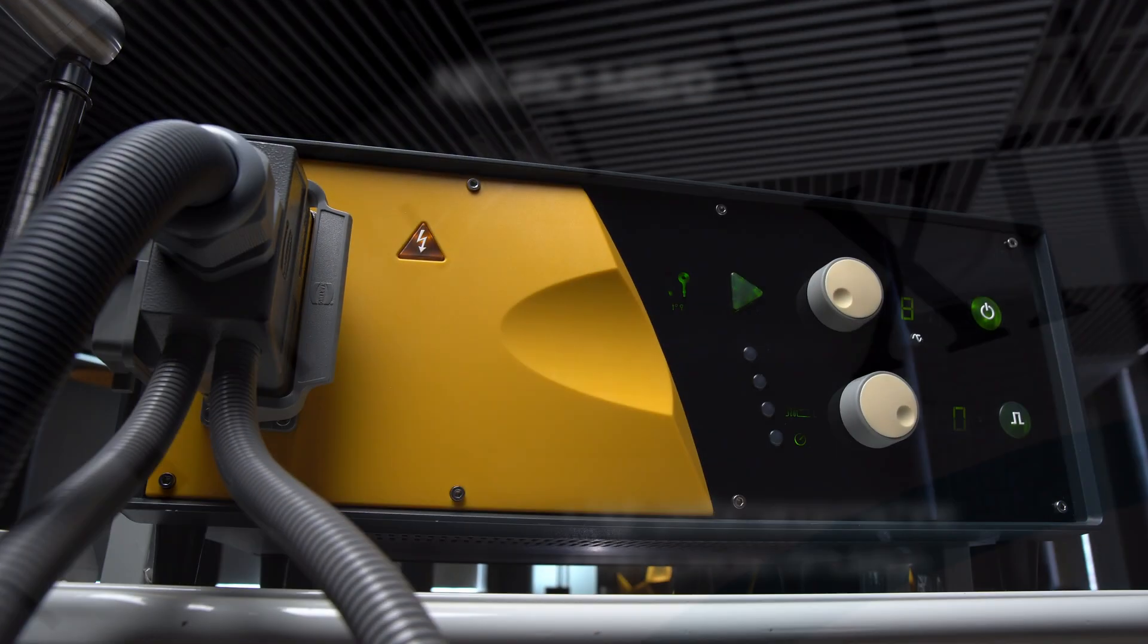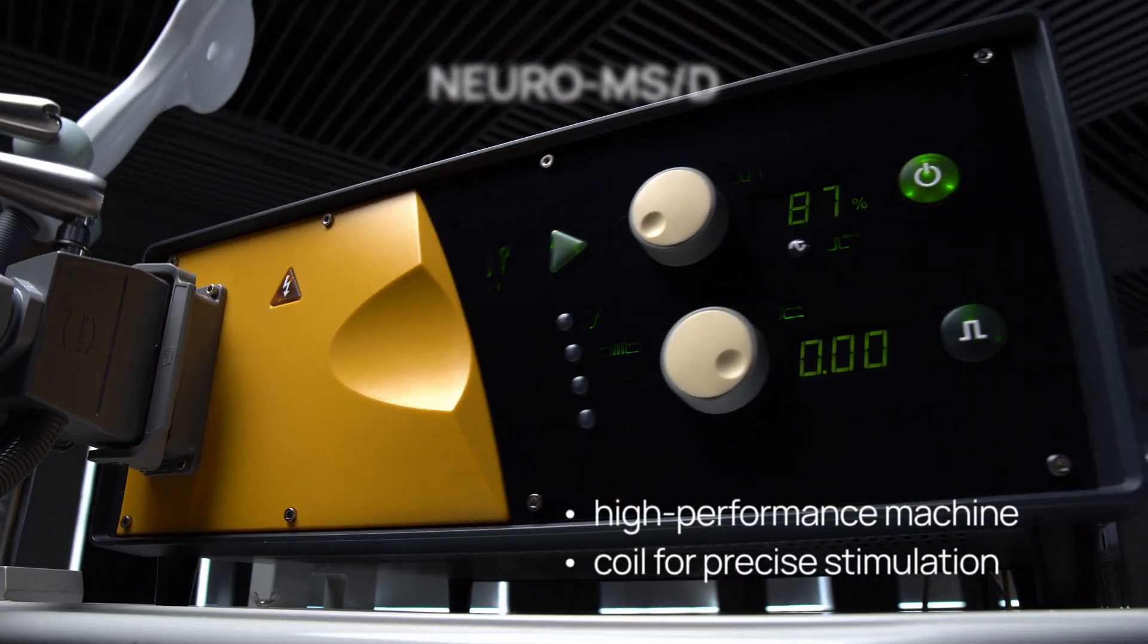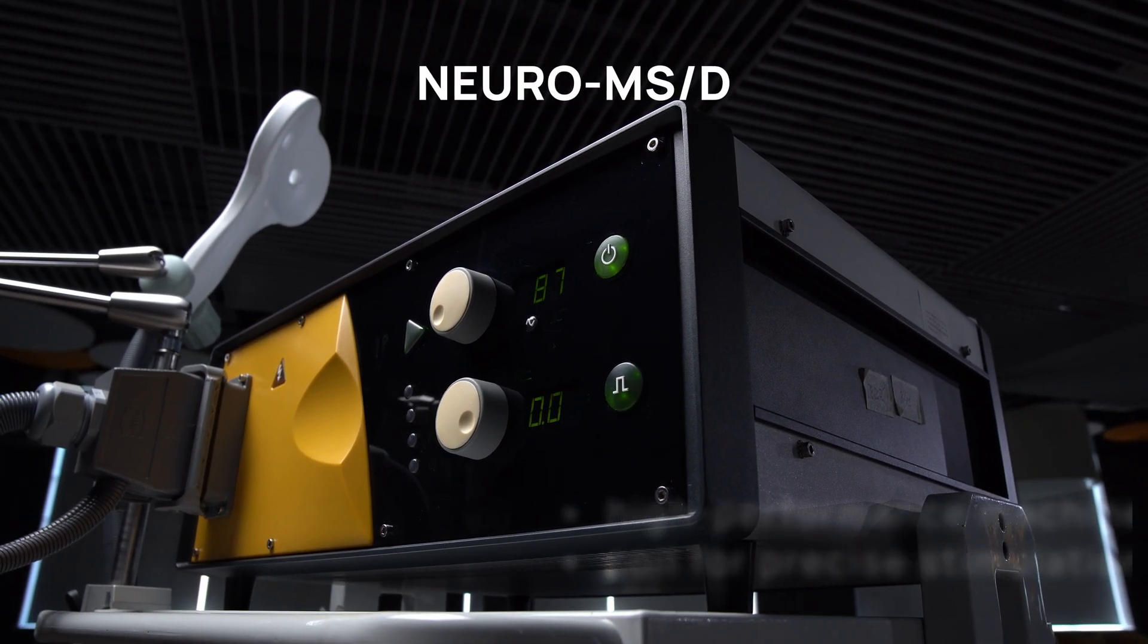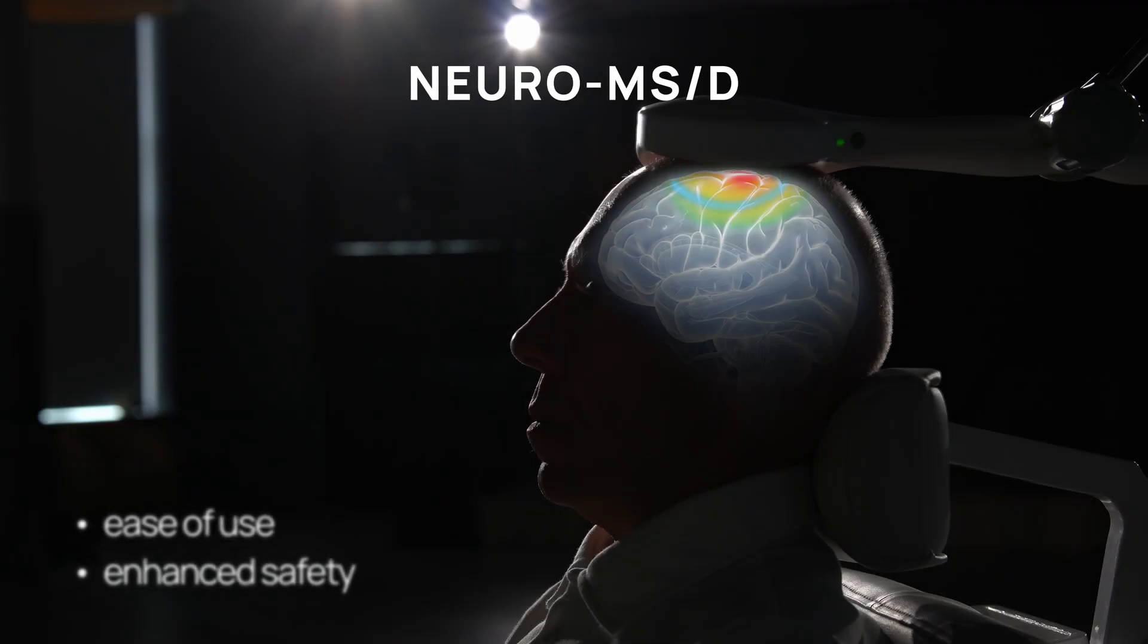Transcranial magnetic stimulation, or TMS, is a non-invasive and painless procedure helping to cope with depression. TMS is typically used when other depression treatments have proven ineffective.